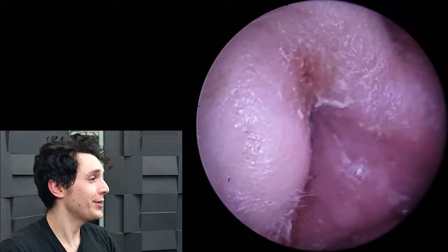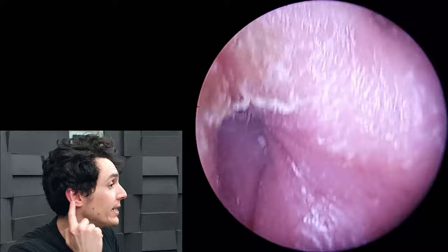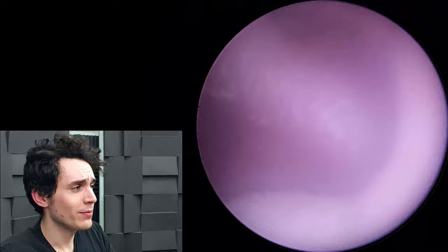We've got a very interesting case here with two problems with this ear. The first is a mild case of otitis externa — examining the outer ear, you can see it's quite red, crusty, with some cracks in the skin.